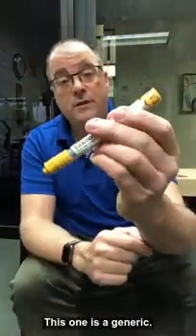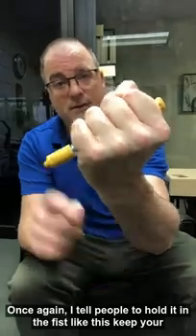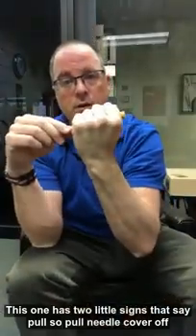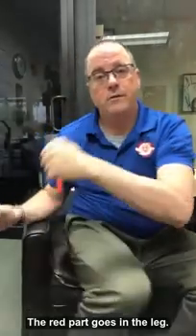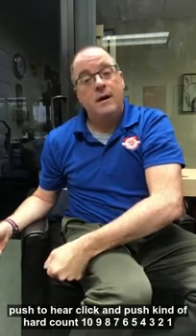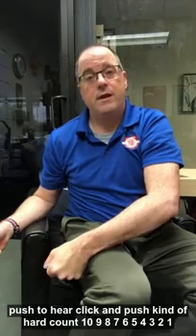This one is a generic. It's called an Adrena click. Once again, I tell people to hold it in the fist like this. Keep your fingers off the top and the bottom. This one has 2 little signs that say pull. So pull the needle cover off, pull the safety off. The red part goes in the leg. Push till you hear a click. You're going to push kind of hard. Count 10, 9, 8, 7, 6, 5, 4, 3, 2, 1.